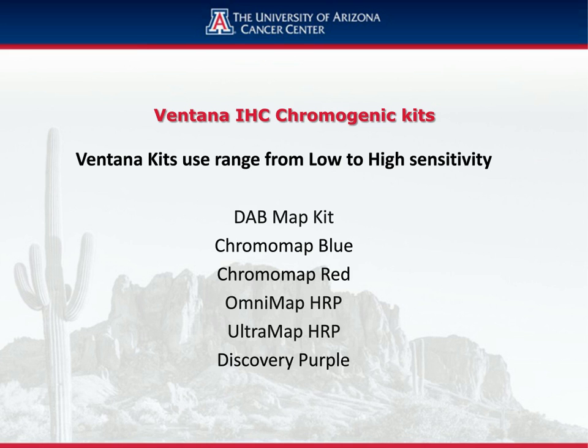I will then, if it's for multiplexing, use a blue, red, or purple map kit. And here I have to be careful when I'm co-localizing. If I have a localized protein, that color doesn't come out burnt orange, for example, that it's a color that can be easily visualized.